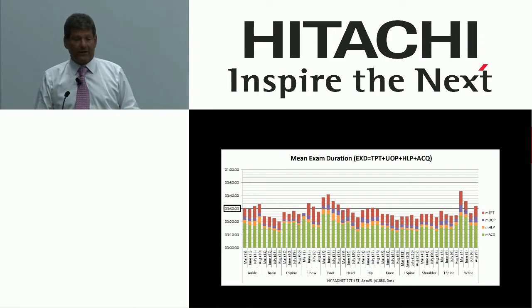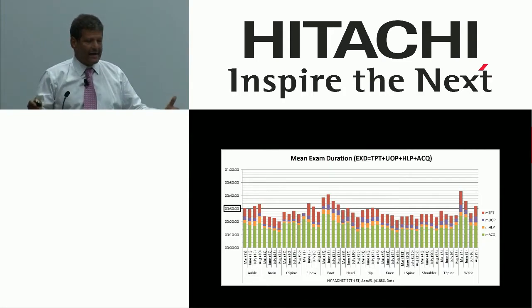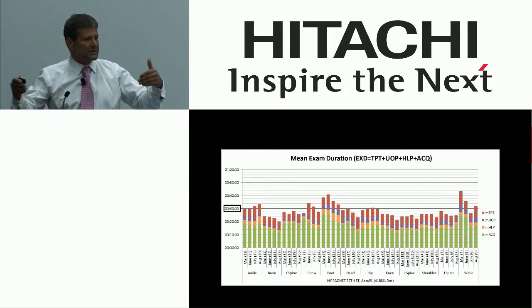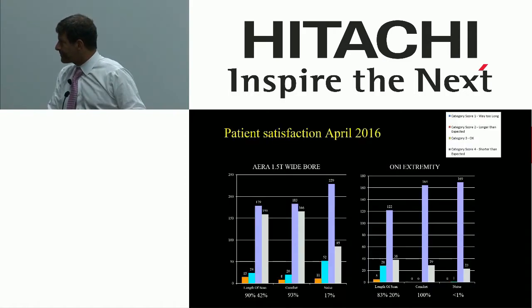So how did I deal with the foot and ankle? We gave them a webinar. Okay, we had a guy go in there and give them a webinar. This is a coronal, this is an axial, this is our coverage, and it just improved the process. We made the effort to educate our team.